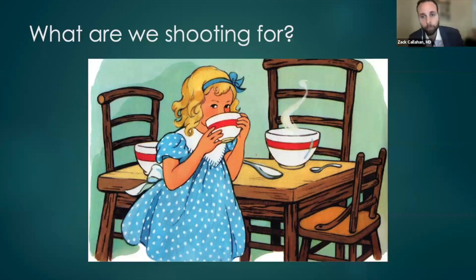So my goal is to help those that are incorporating impedance planimetry into their POEM practice kind of have an evidence-based concrete number to shoot for. And I think when POEM came out, we were no longer limited by surgical exposure. So these early adopters, I think they were happily opening the muscles as much as possible. We're doing full thickness myotomies, extending myotomies, very long lengths.